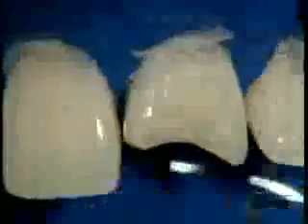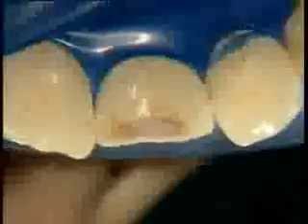The lingual bevel is then produced, using an ovoid burr. This allows us to create a bevel with clearly visible edges that can be easily recognised. An abrasive strip finishes the proximal surface. This lingual view shows clearly the limit of the preparation. At this point, the whole of the preparation is finished, and we can start on the adhesion procedure.